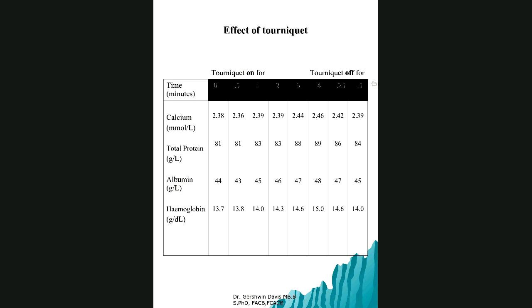Right? So in other words, the message here is that if you're taking blood for calcium, you put on a tourniquet. Notice this is not in any notes. You put on a tourniquet, so we have increased venous pressure, you have your dilated veins, you get a needle in the vein, then you release the tourniquet, and then you withdraw blood. So that's how phlebotomists take blood for calcium, to avoid this hemoconcentration effect. Okay? Tourniquet on, the veins become prominent, you get a needle in the vein, and then you release the tourniquet, and then you take out blood.